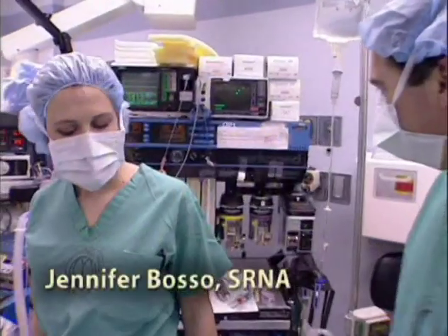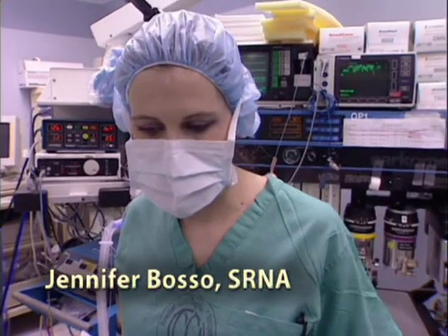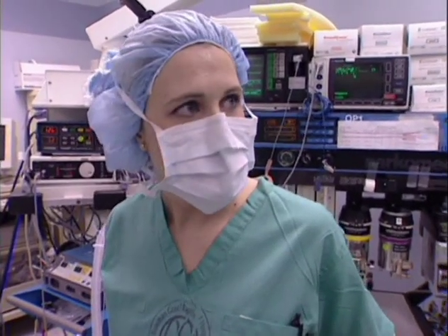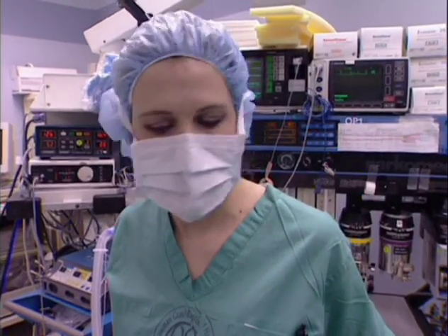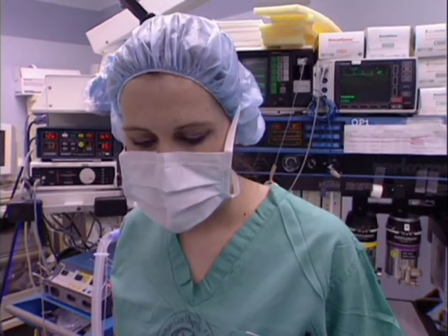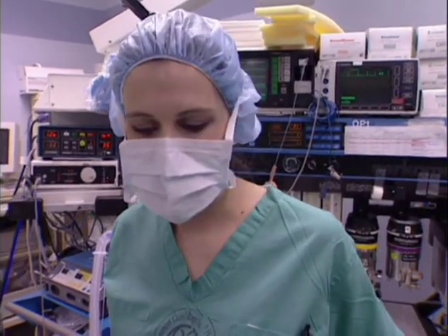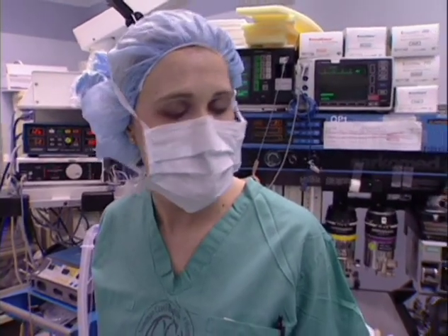Jennifer, what do you have planned? What we're planning on doing today is a one-breath inhalation induction. So what we're going to do is have the patient take a large breath in, take a large breath out completely, and then we're going to have him take a vital capacity breath back in and hold it and breathe normally after that. He should fall asleep within about 60 seconds.